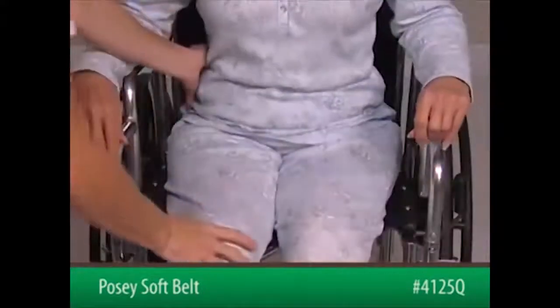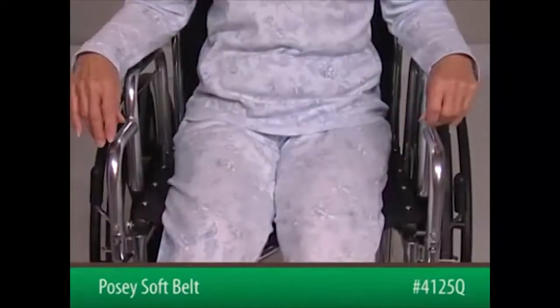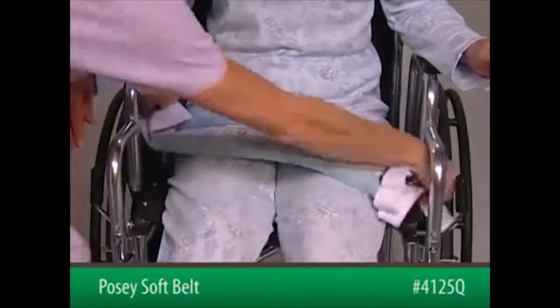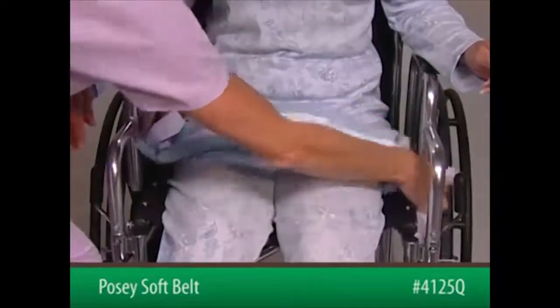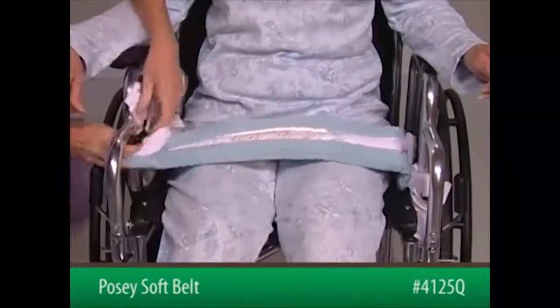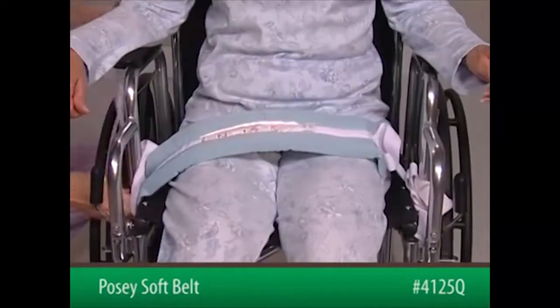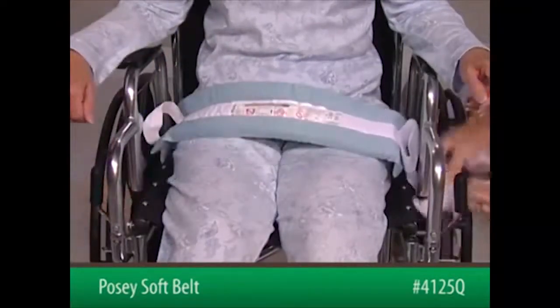Next, position the patient as far back in the seat as possible. The patient's buttocks should be against the back of the chair. Lay the belt across the patient's thighs with the foam facing in. Bring the ends of the connecting straps down between the seat and the wheelchair sides at a 45-degree angle.